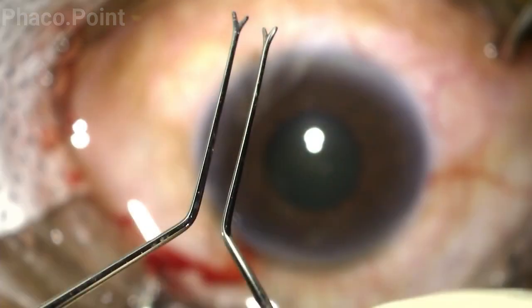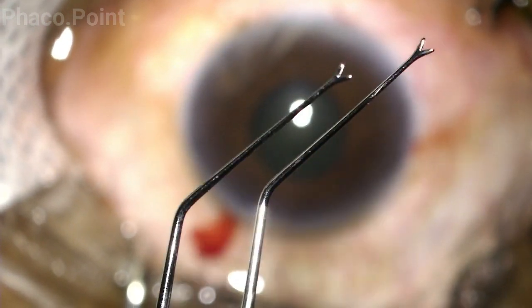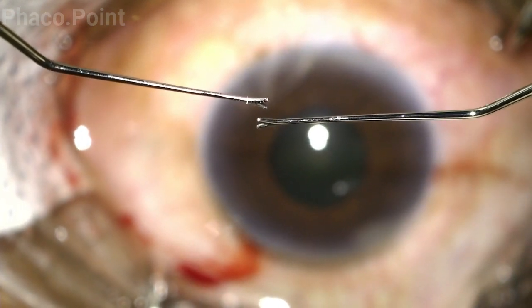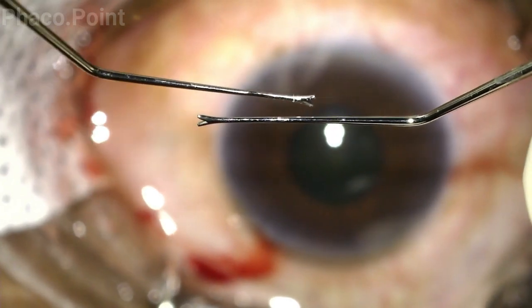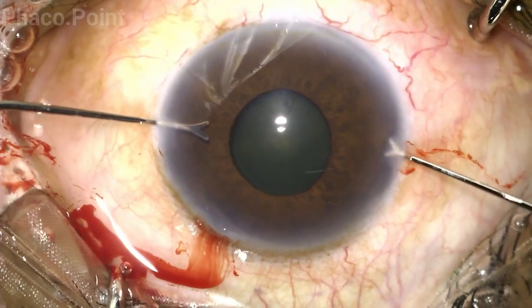Now these are the two Y-shaped hooks that we will use to create the pupillary stretch. Let's now understand how it is done. These are both the Y-shaped hooks, and this is the orientation when introduced into the eye. Once the pupil is hooked, it is this movement that results in a pupillary stretch. Let's watch this surgical maneuver.